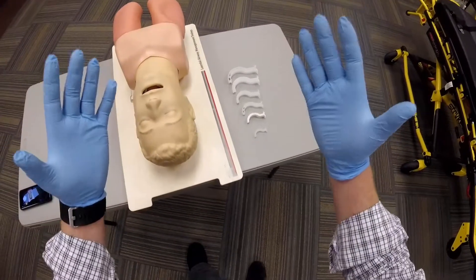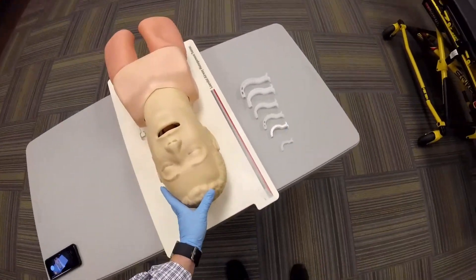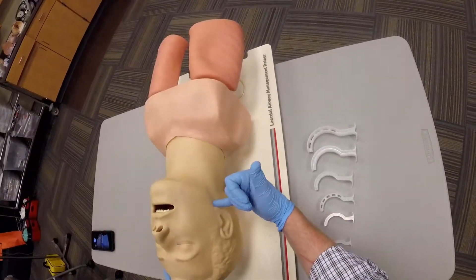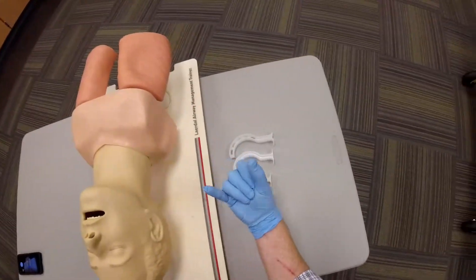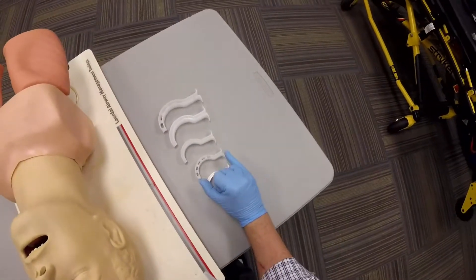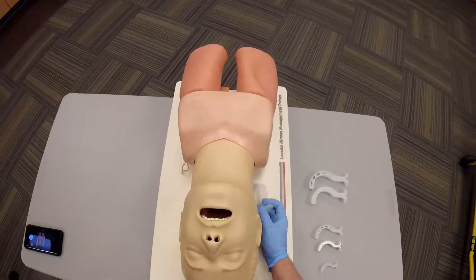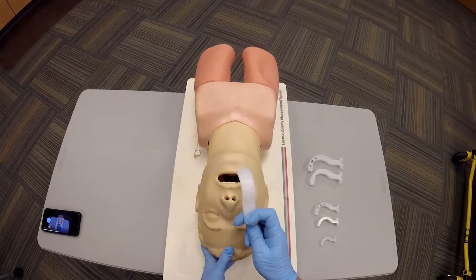OPA insertion. BSI. My patient is unable to maintain his own airway. I will measure from the earlobe or angle of the jaw to the corner of the mouth. I will mark that and identify the appropriately sized OPA. I will open the airway with a head tilt, chin lift, or modified jaw thrust.